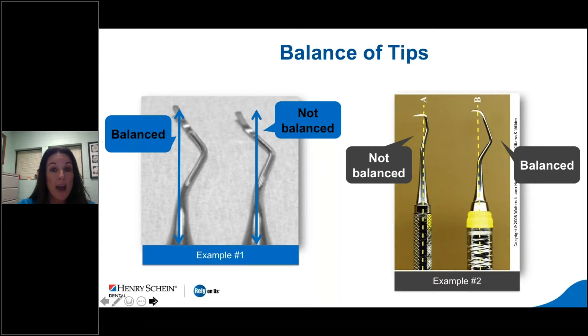When we look at the instrument, we want to make sure we have a balance of tips. Working ends are aligned with the long axis of the handle. Balancing allows finger pressure to be transferred more effectively to the working end, reducing muscle stress on the hands and arms. When the instrument is not balanced, the lateral pressure when activated causes the instrument to turn slightly in the clinician's fingers. The shank should be parallel to the working end — this indicates a balanced instrument. Less ergonomic stress with better precision means better control and less tissue problems.